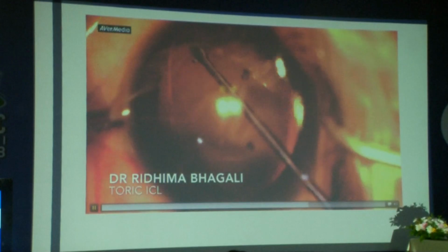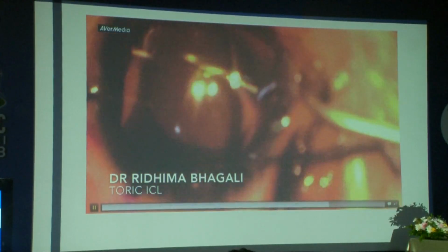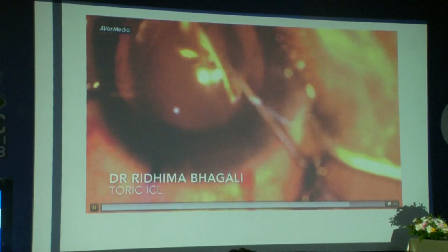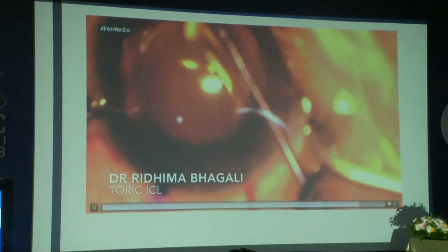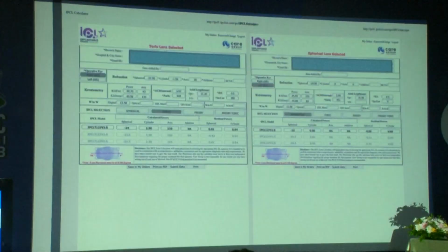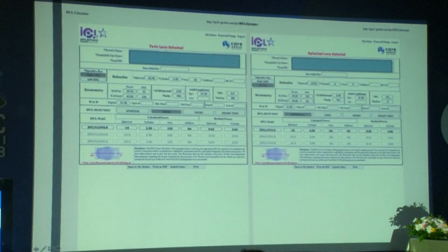I think Dr. Mukesh in his subsequent talk is going to elaborate more on these surgical steps and tips and tricks to make it a little easier for you. But this is just to show you, demonstrate the loading of the ICL versus the other lenses that I'm going to discuss further. There are a lot of situations wherein, as I said, it's available only up to -18 diopters.